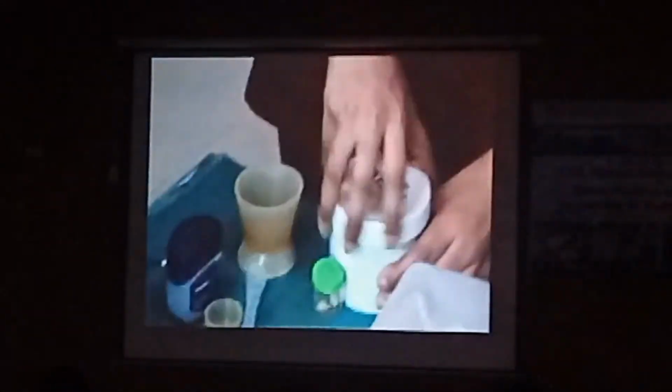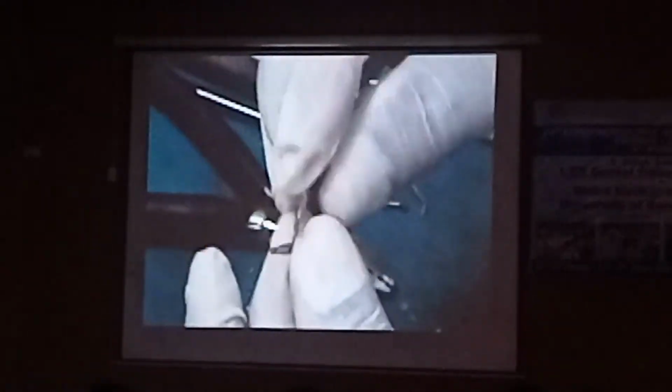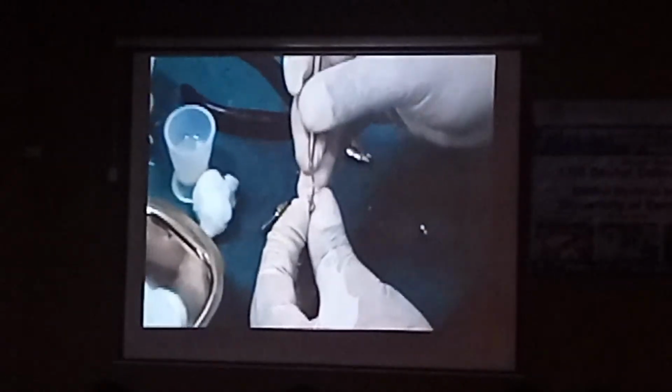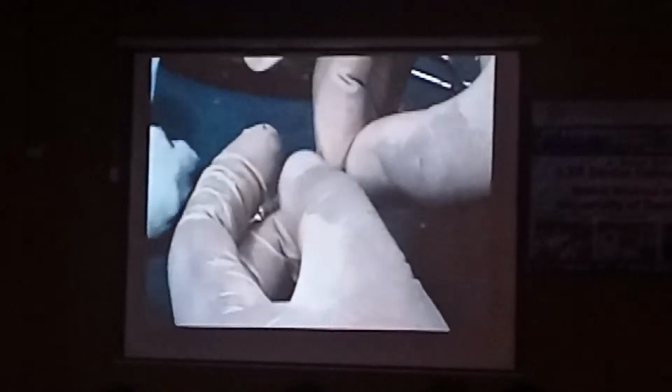What tends to happen is if you keep on using the same hex driver and the same components, the top of the hex gets deformed, right? So that it does not engage into your components clearly. Secondly, the top of the negative of the hex, that is here, also gets deformed, right? So you cannot reuse your components n number of times. Another thing that happens is these threads get worn off, they start leaving residue.